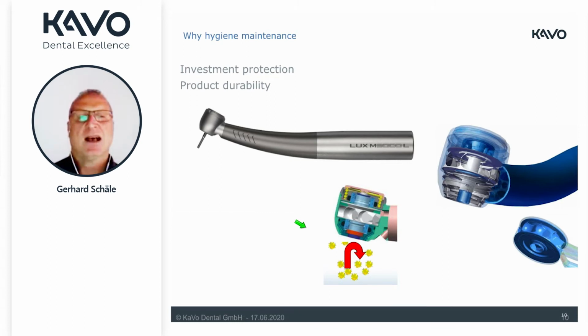All parts which are removed from the tooth, that means enamel, dentine, salt solution, salt particles, could be sucked into the inside and could create a problem, especially in the movable parts. As well as possible, we want to avoid that these particles crawl into the inside and start to create mechanical abrasion.